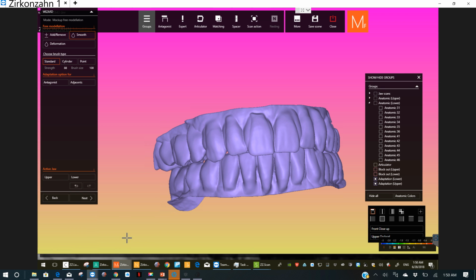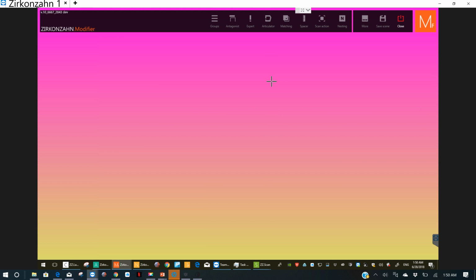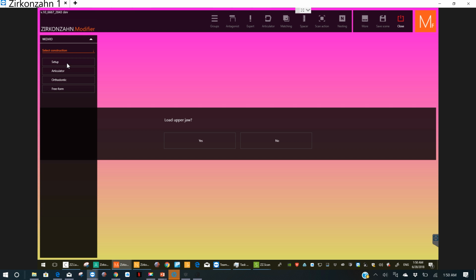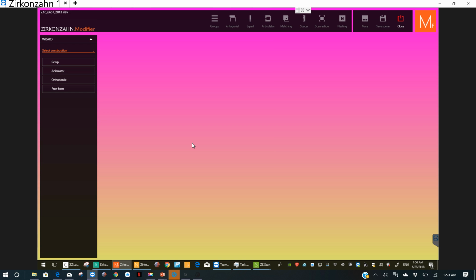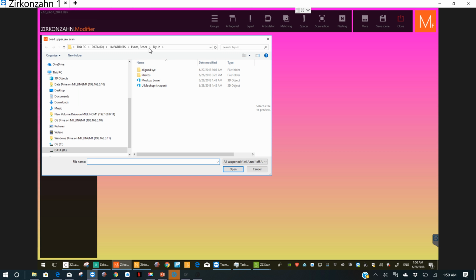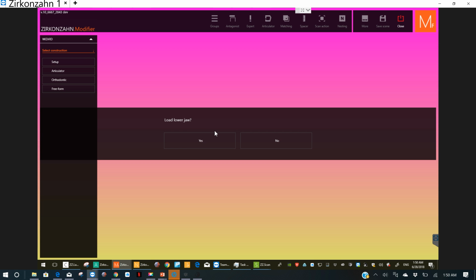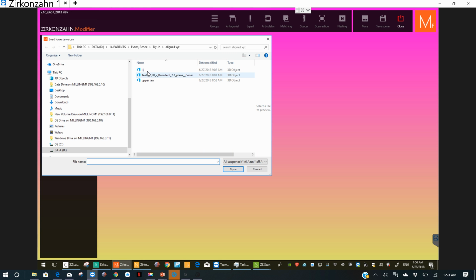So you open up the modifier and create portrait, and you go to setup. Almost always go to setup. So load the upper jaw, go find your patient, and upper jaw, and you want to upload lower jaw. Let's do that one.